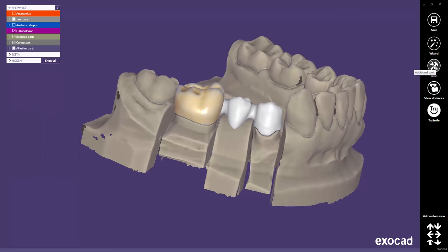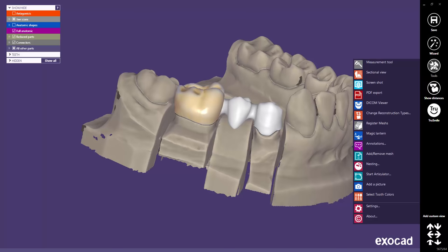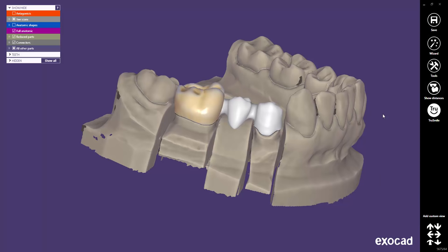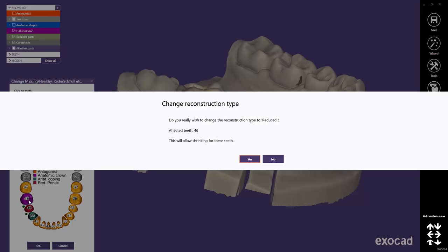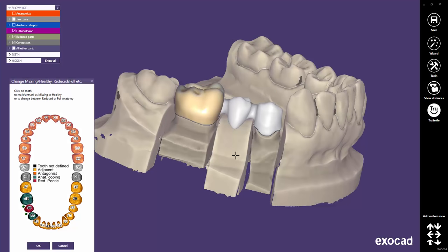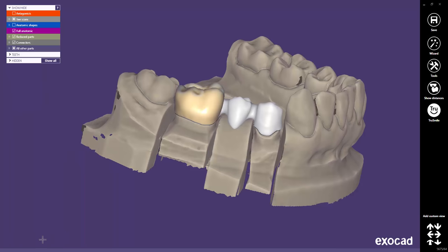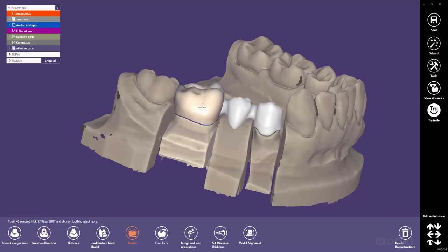In the tools, you will find a feature called Change Reconstruction Types. In this window, you may change Anatomical Teeth into Reduced Teeth with a click. Confirming this change will allow shrinking for these teeth. Now, it is very important to select the tooth you want to shrink first. Otherwise, the other teeth will be reduced again when you click Reduce in the expert mode.